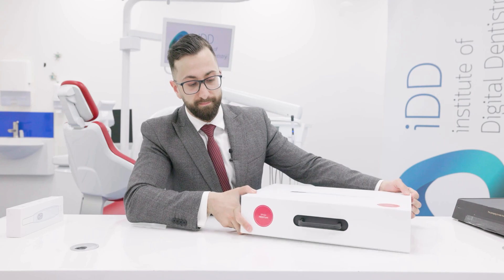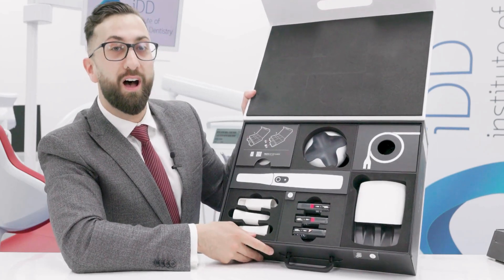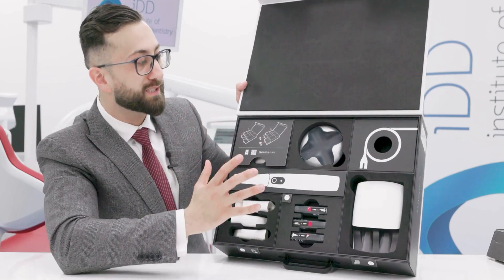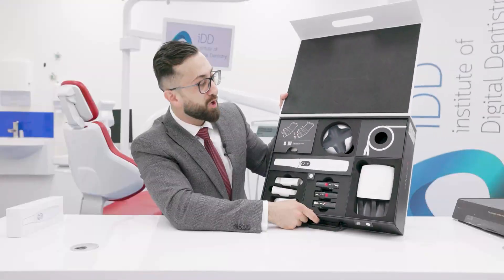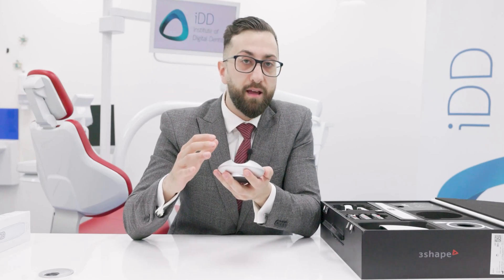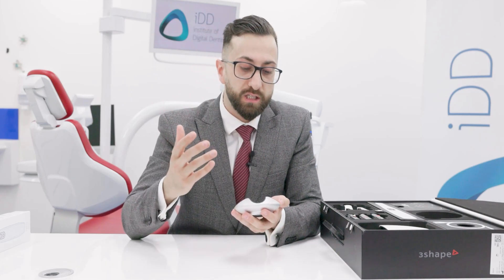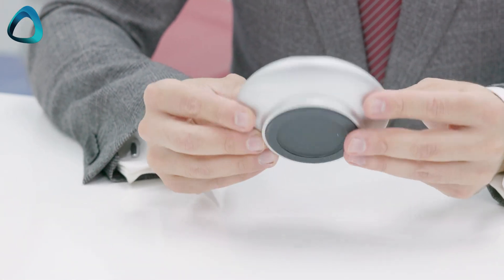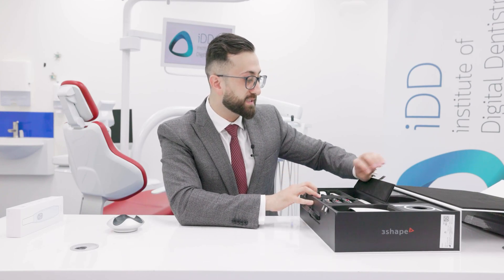Opening it up, this is some really high-end packaging. I love how all the scanner companies are really outdoing themselves on how they present their products. First things first, this is the docking station. 3Shape has taken the opportunity to really rethink hygiene for their scanners — there's a big push to make these scanners and all their parts as hygienic as possible. The docking station is made out of basically one piece with rubber and can be easily cleaned.